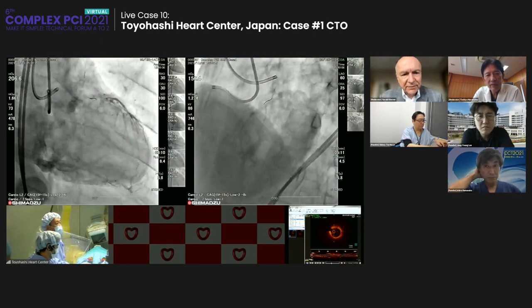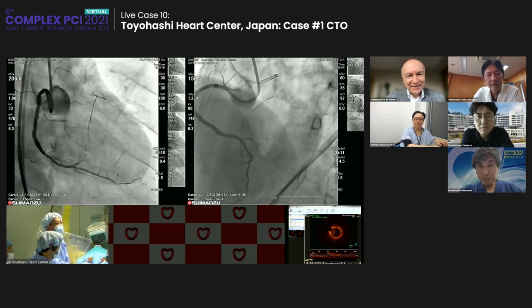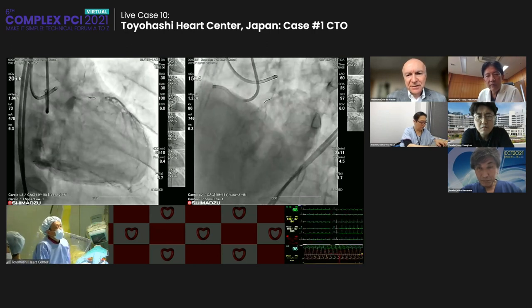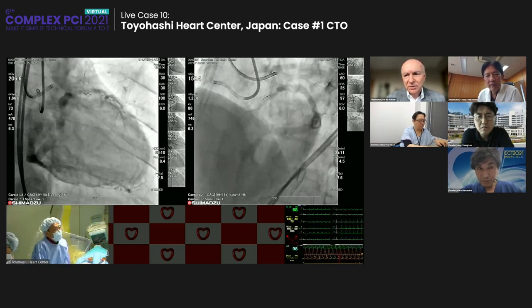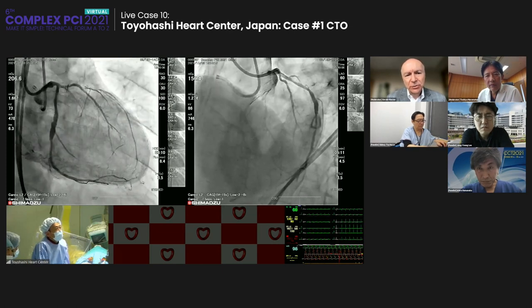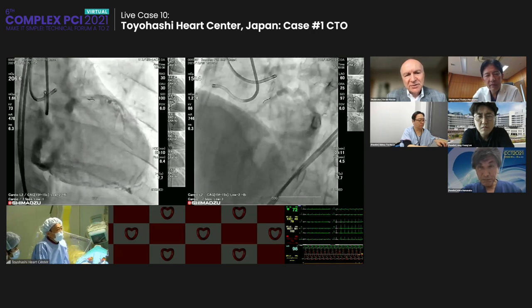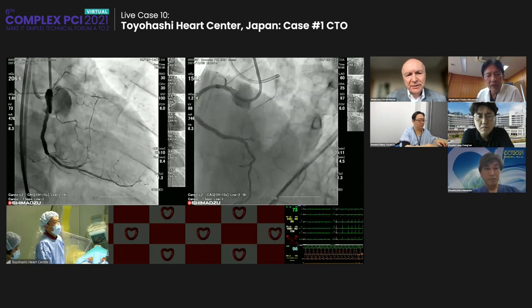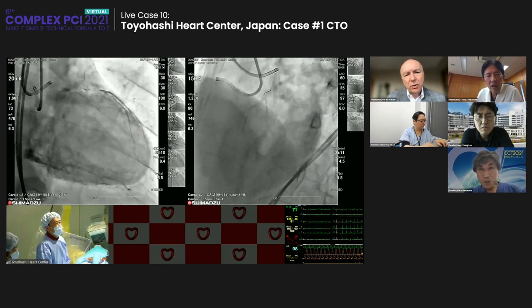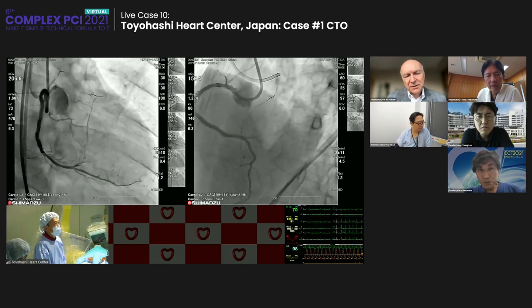This is really a very unusual story. Yes. We assume that the wire was left inside the lumen. I thought that we saw the wire on the OCT. It was not covered by a new stent, I understand. I think so. If you left the wire inside, an idea would be to at least put it against the wall by covering it with a second drug-eluting stent.